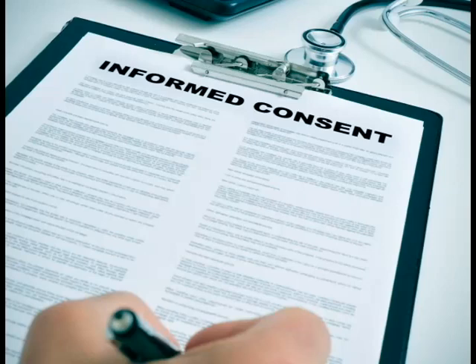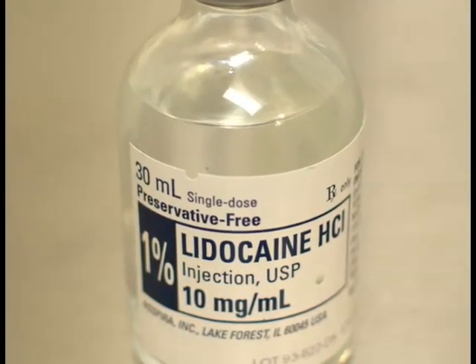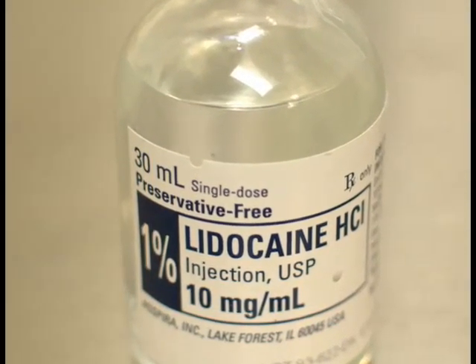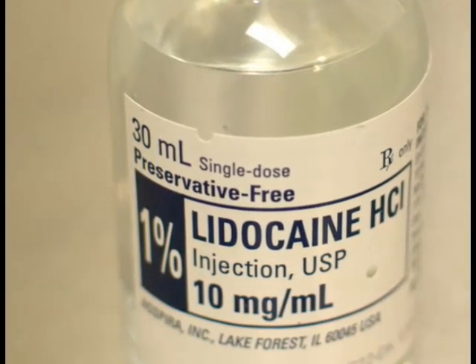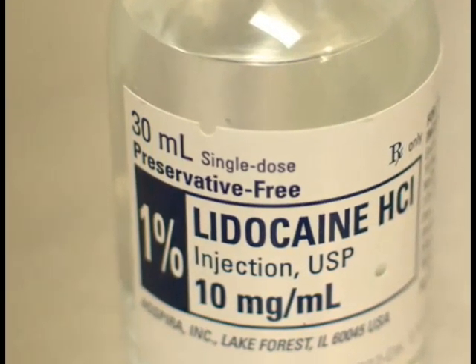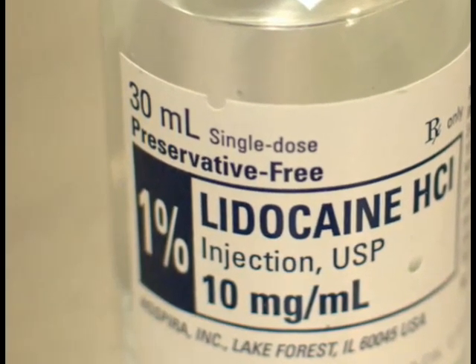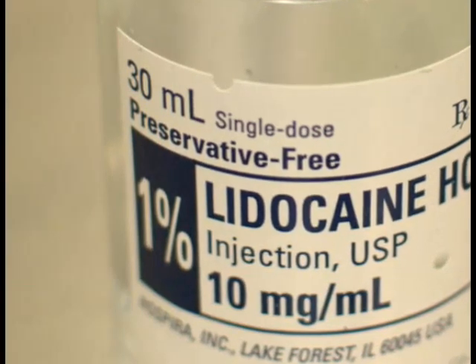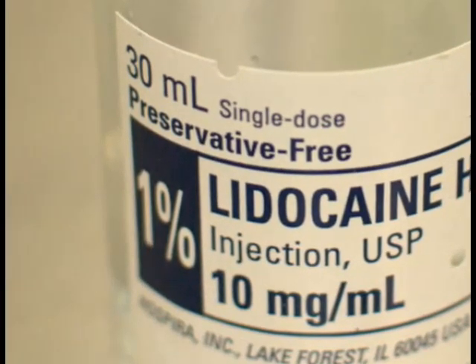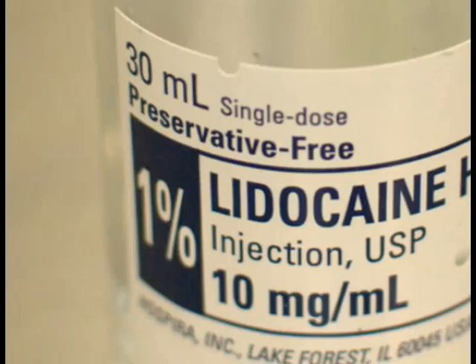Anesthesia: If the patient is in severe pain, too anxious, or is unable to cooperate, a local anaesthetic agent can be administered. For example, using a 25–27 gauge needle, one can give a subcutaneous injection of 2–5 ml of lignocaine 1% to the aspiration site. Remember not to administer deep injections, as this can alter synovial fluid analysis.